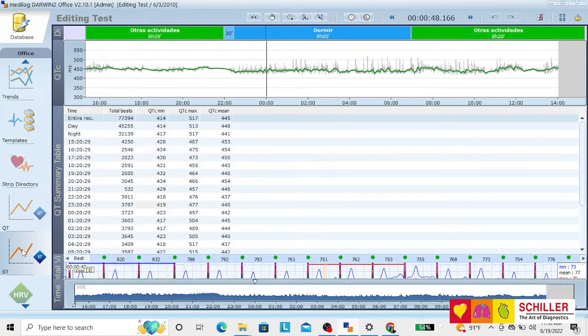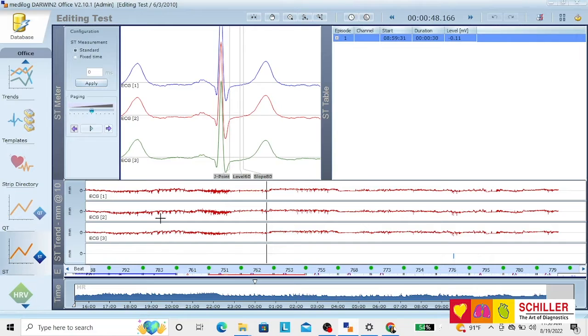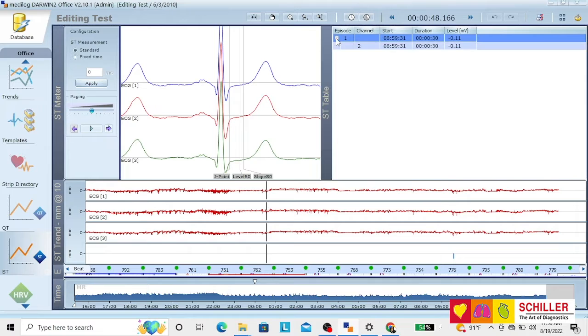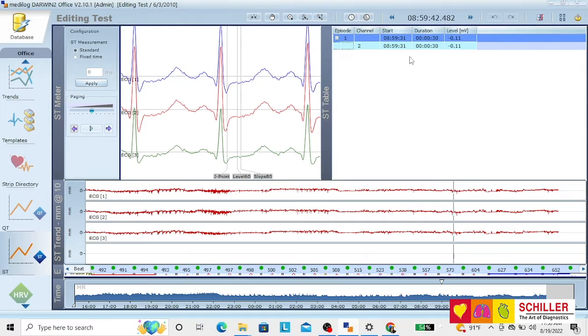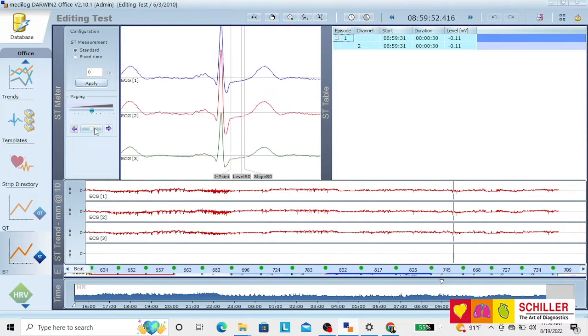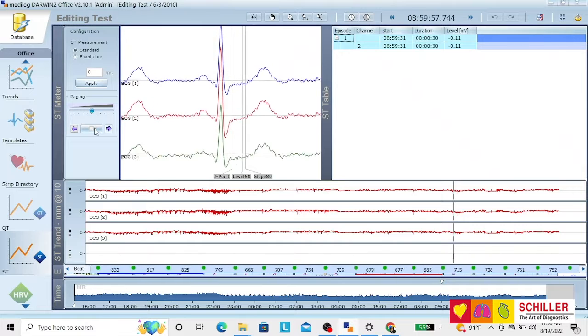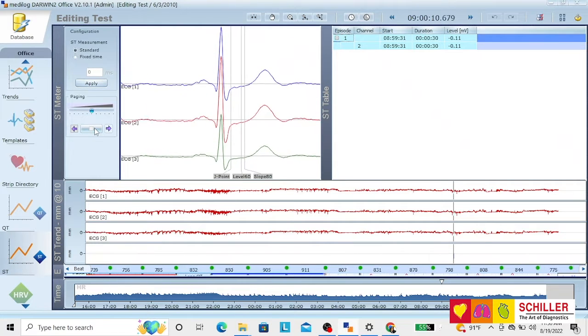For ST measurement, you will have the trend of the ST on the three channels, all the episodes, when they happened, how they happened, where are the levels, the duration, etc. You can also see the analysis beat by beat.